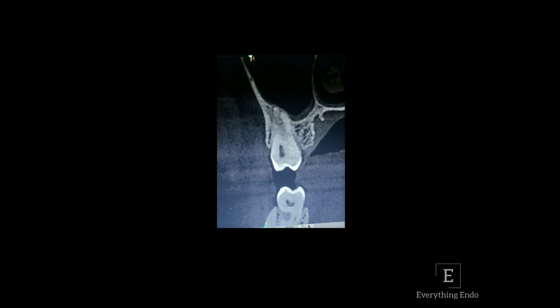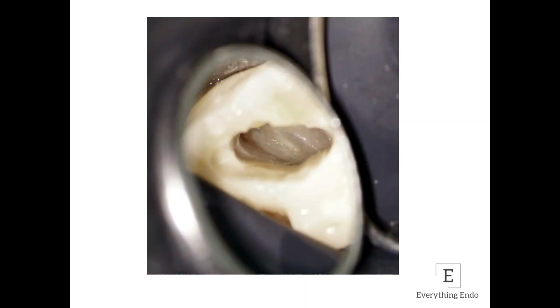This is the frontal view of the same. And again, it clearly shows us the presence of more than just the MB canal on the mesiobuccal root of the maxillary first molar. Though this is all the pulp chamber had to offer in this case about where the MB2 canal was present, thanks to the CT that was taken prior, we knew exactly where to go ahead and locate the MB2 canal.